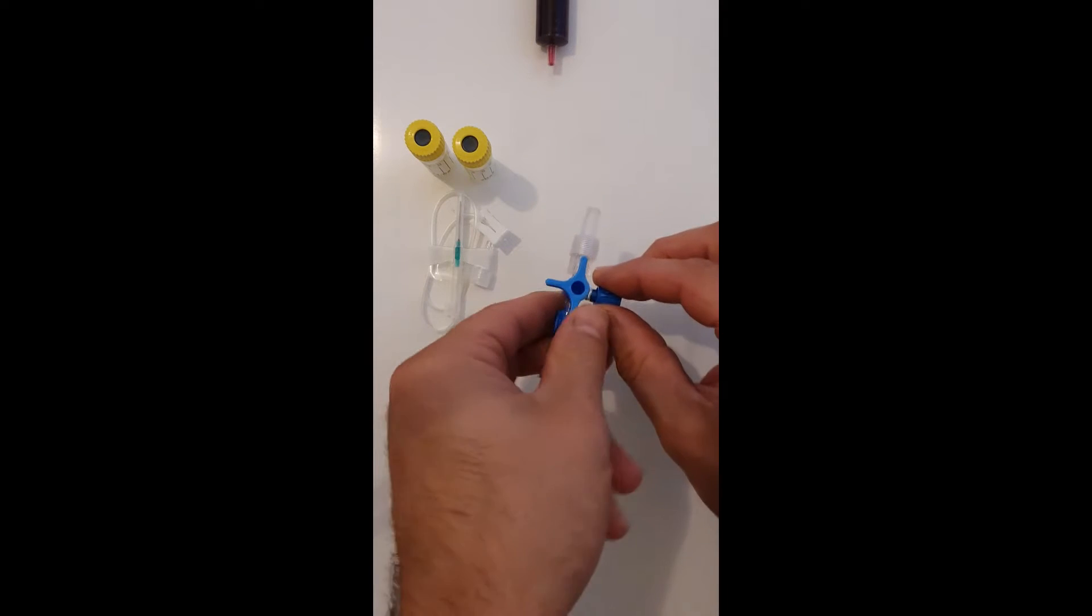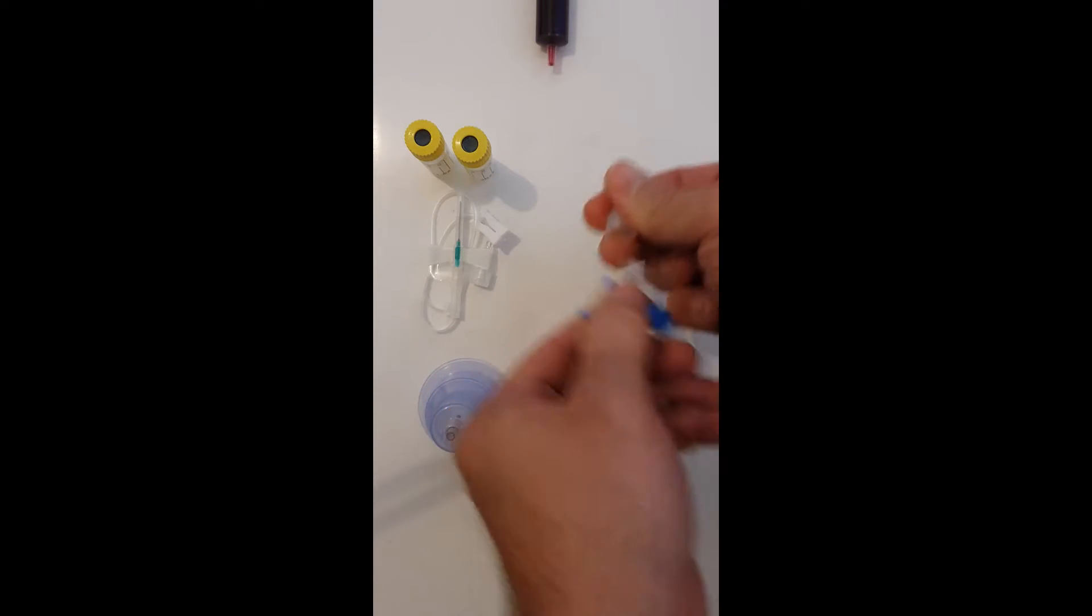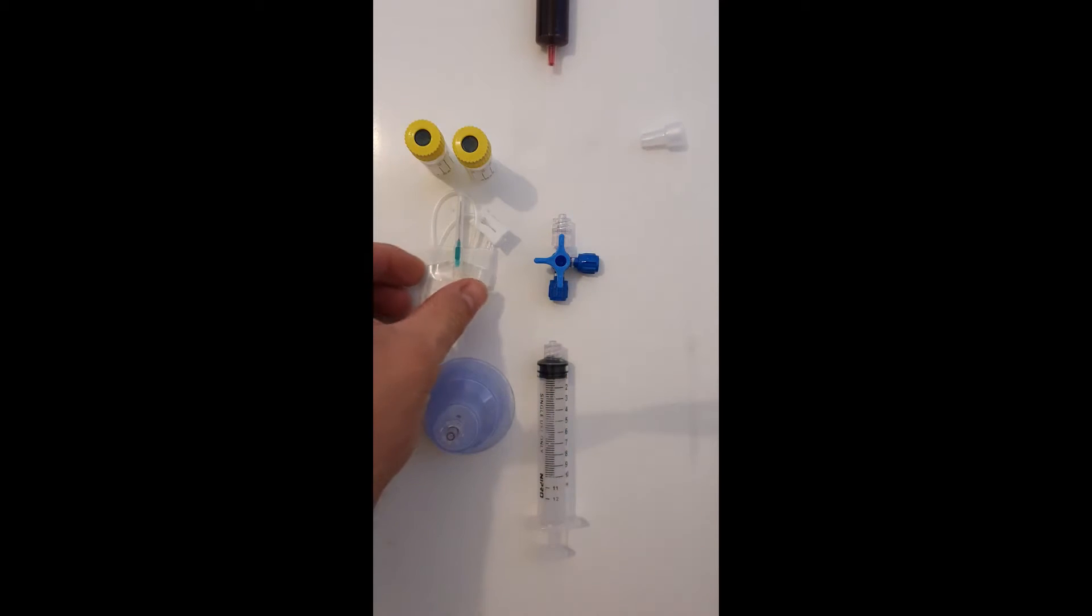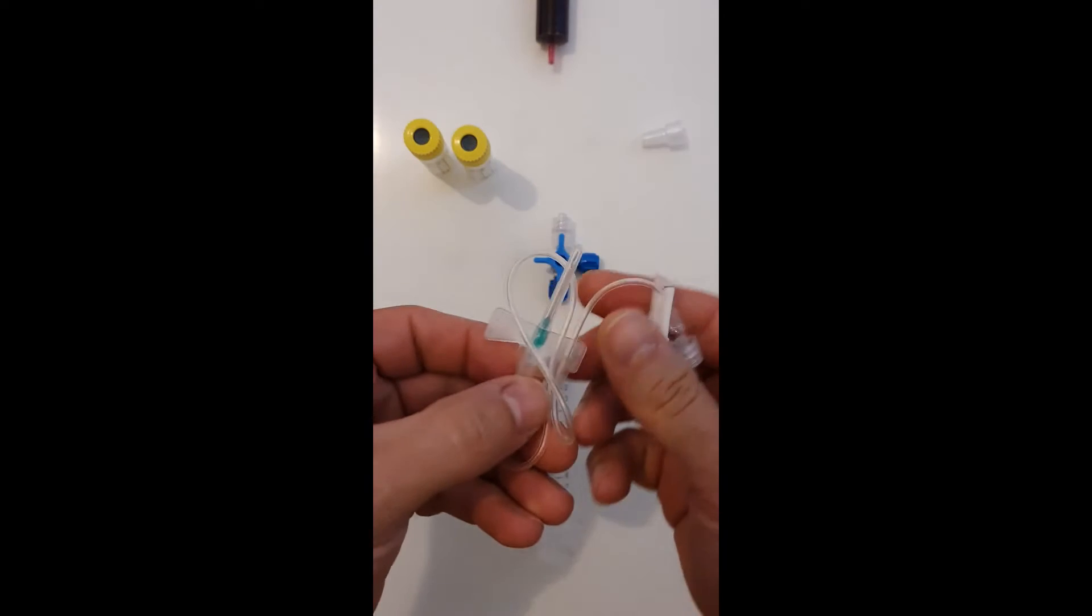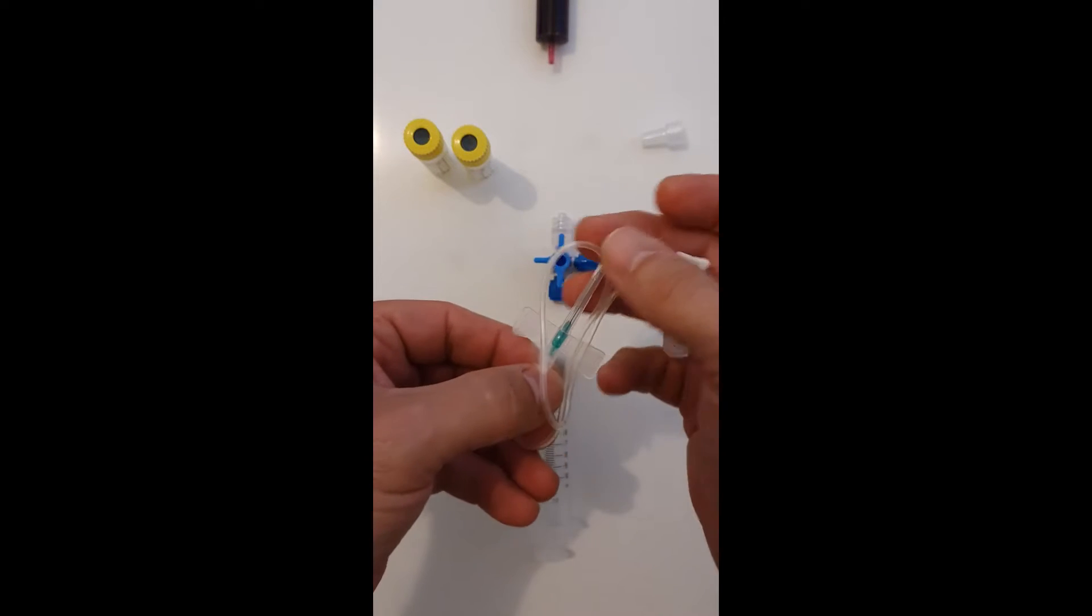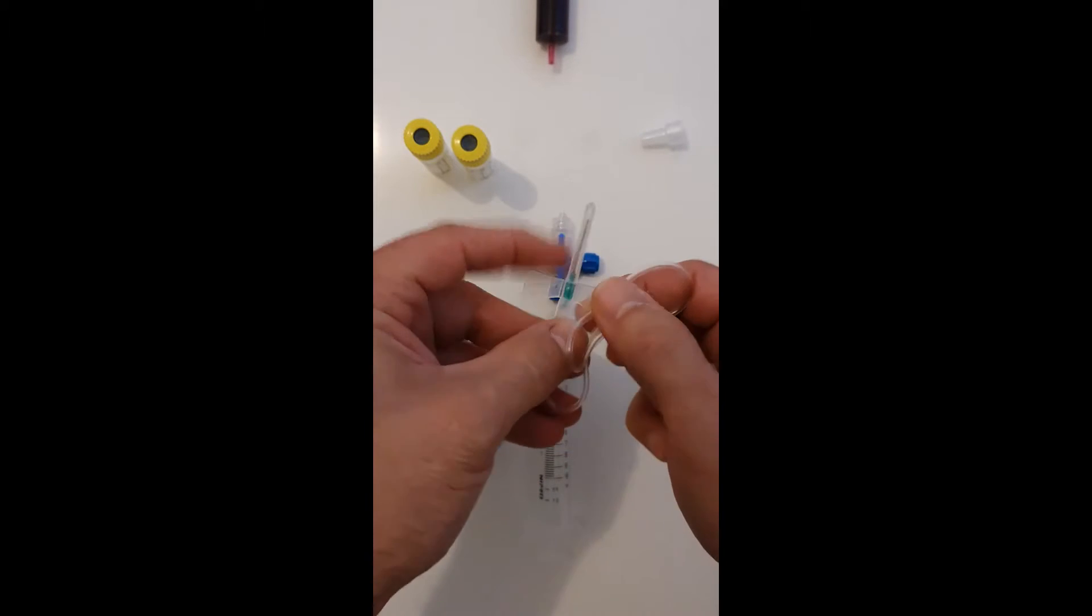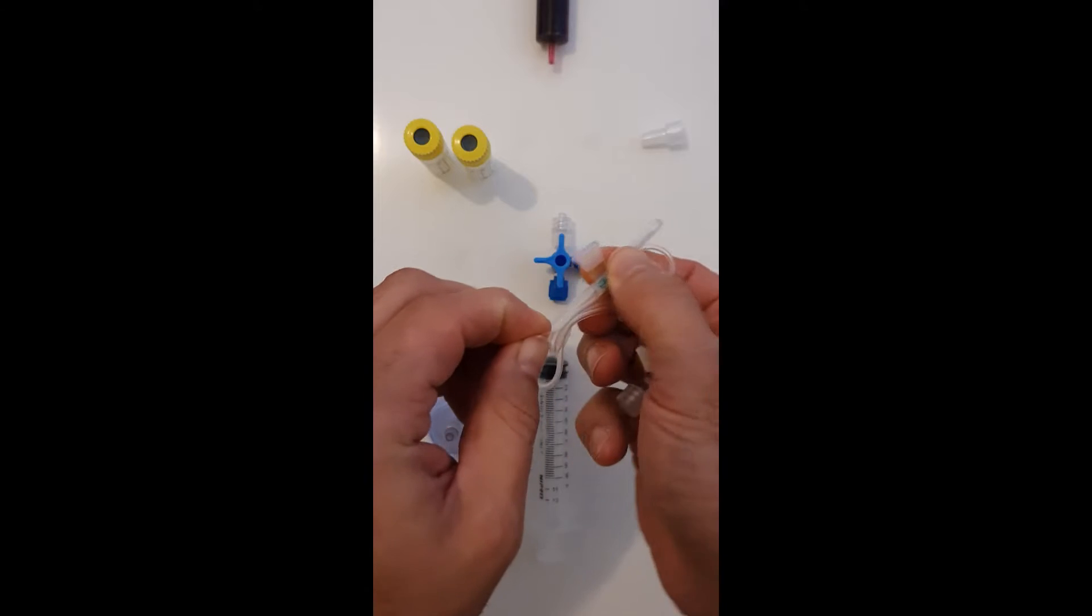What you're going to simply do is remove the end cap. You've then got the needle. As you can see, this is a safety butterfly needle. This is on a 30 cm tube.